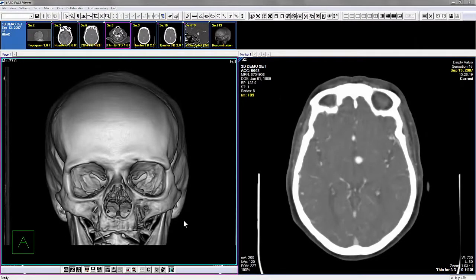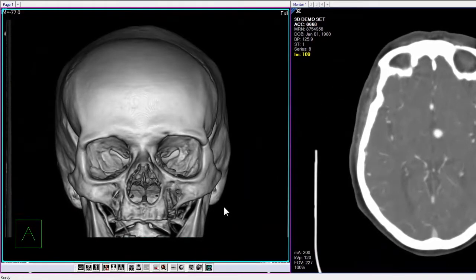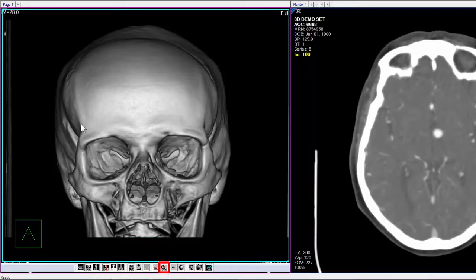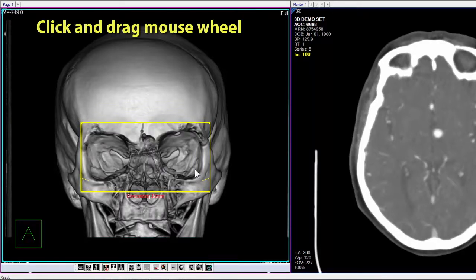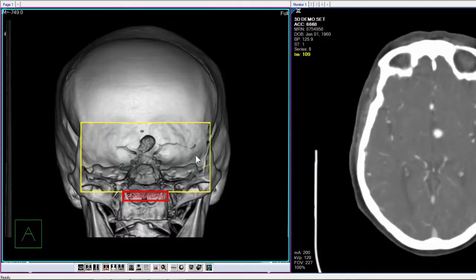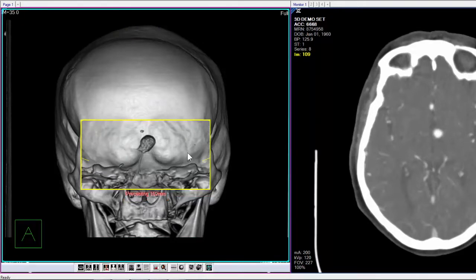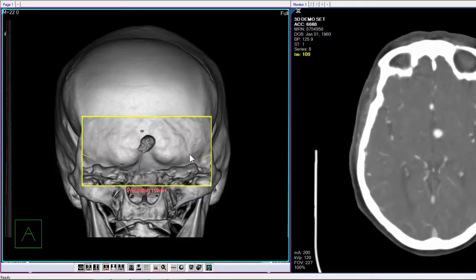The spyglass tool is used to define a region of interest in which you advance through the volume without affecting the image outside the region. Select the spyglass icon from the toolbar. Left-click and hold to draw an area of interest, then click and drag the mouse wheel to start the precast. The precast distance is displayed along the spyglass border. Please note this tool can only be applied to volumes rendered in a DVR projection and full reconstruction mode. Please refer to the manual for additional options and details.